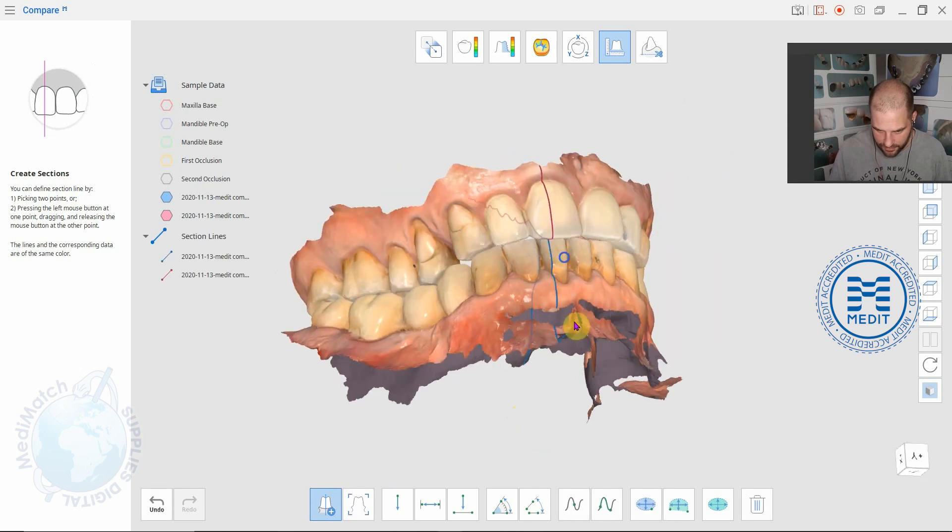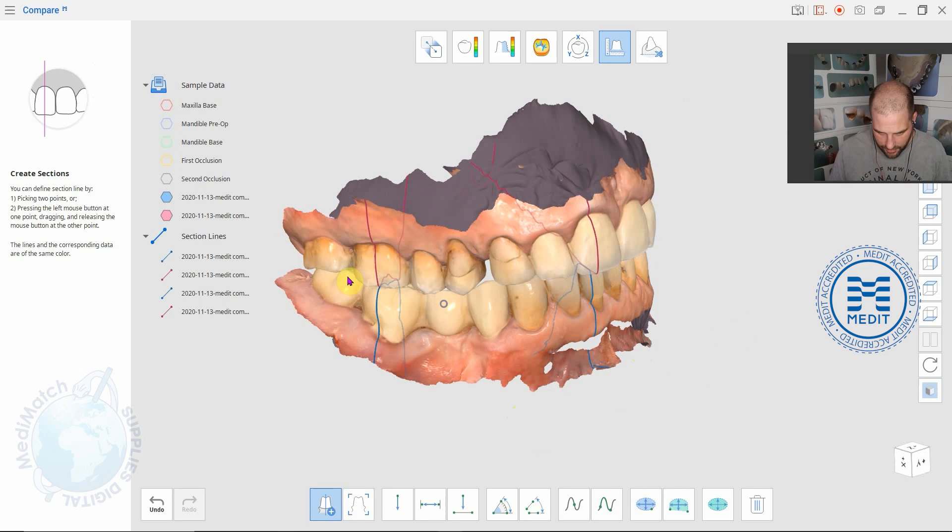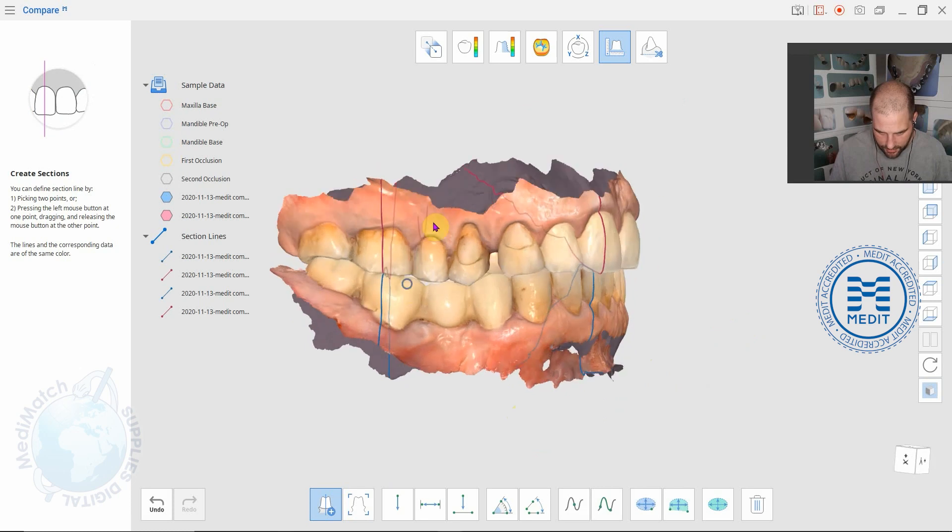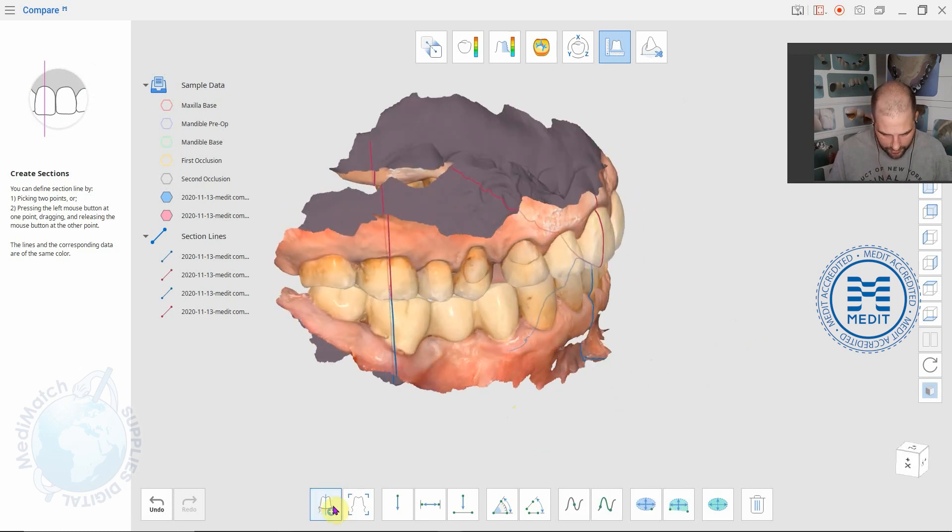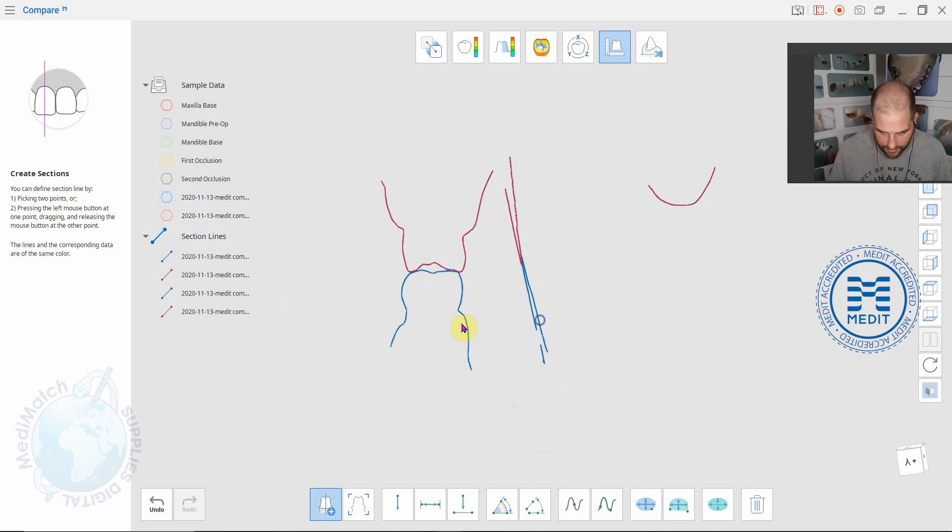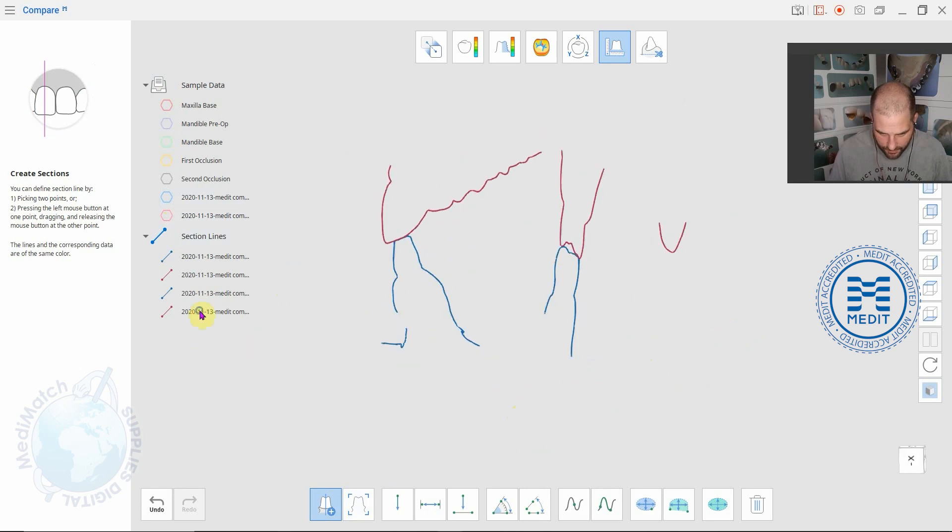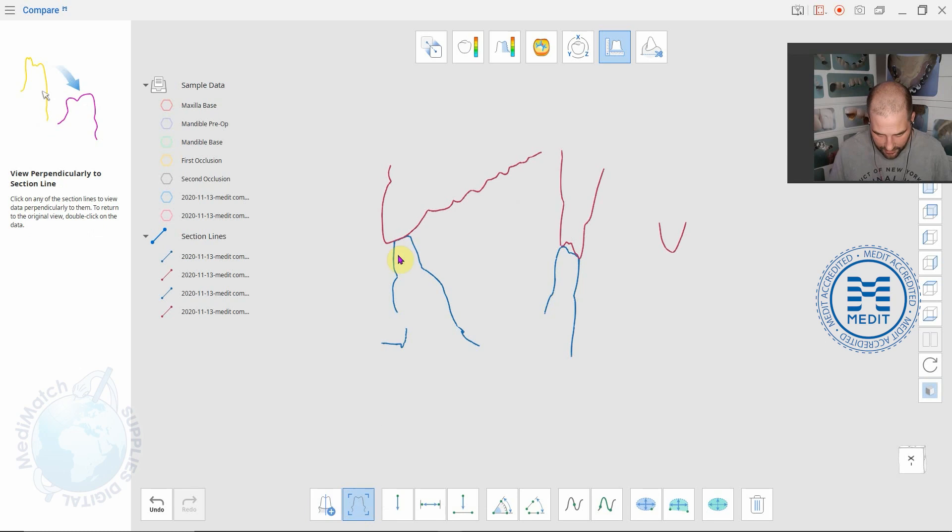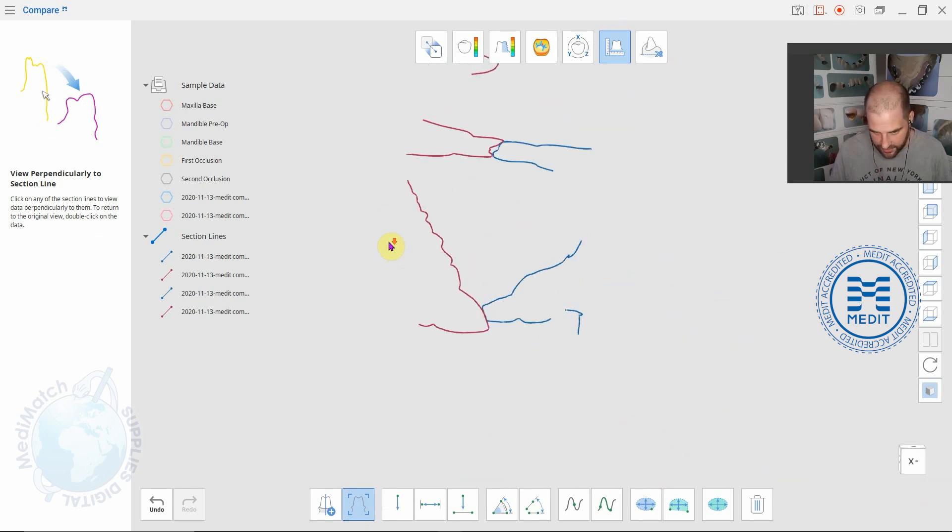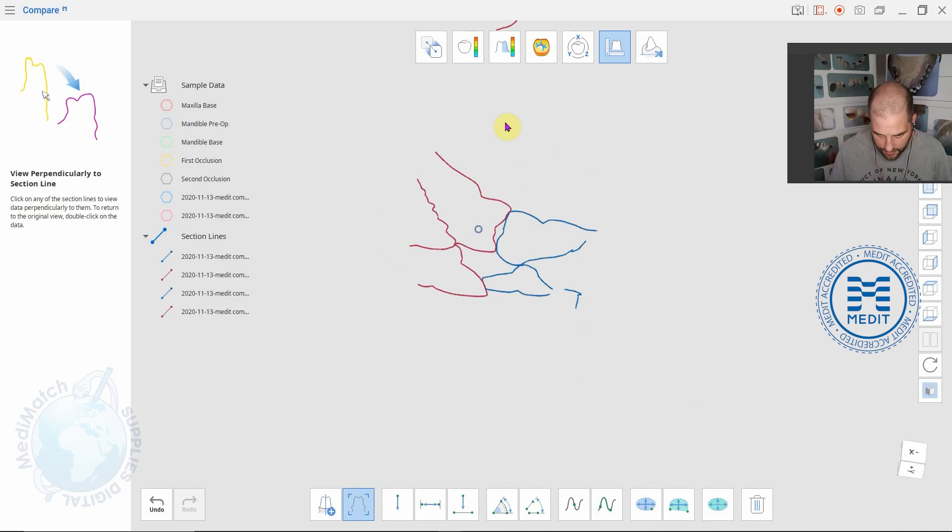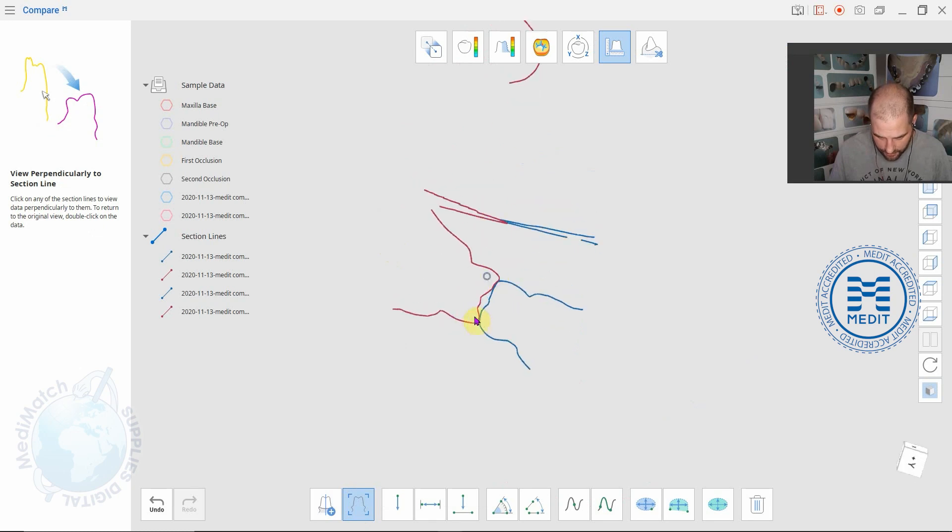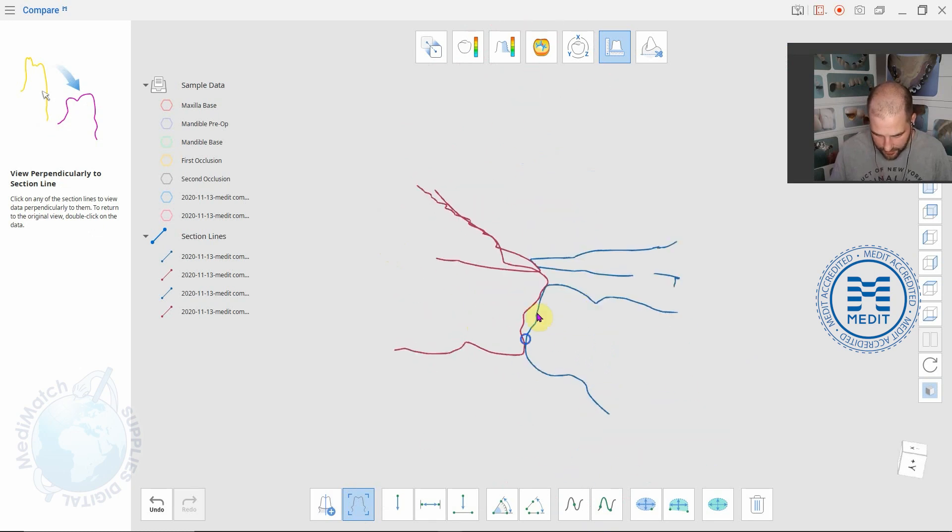For example we can do some lines here and here or wherever we want and we can then turn off these views and just keep the lines. If we click on this one here, view perpendicular to section line, we click it and then click on the line and it'll bring us in square to that line. Same again if we do it up here it'll bring us in square to this one.